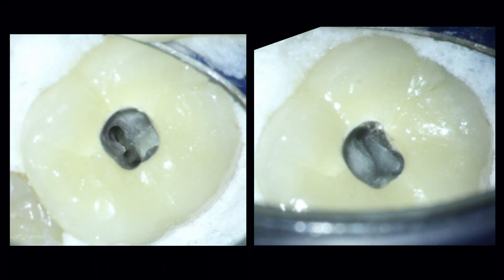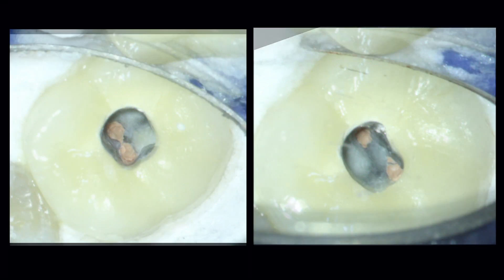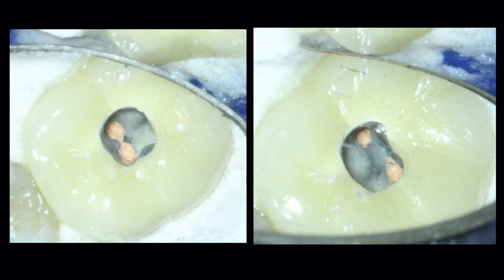Once all the canals were located, I followed my normal shaping and irrigation protocols. I used a modified single cone obturation technique with a bioceramic sealer to obturate this case. I say modified single cone technique because I did apply a bit of vertical heat limited to the coronal third of this root canal system, and then backfilled it with warm thermoplastic gutta percha.